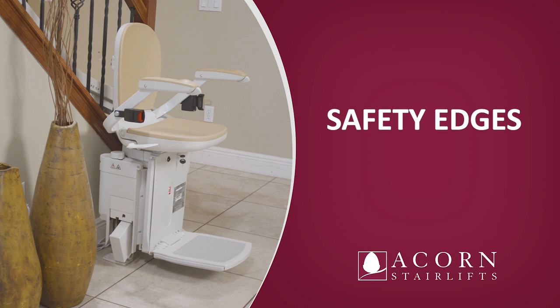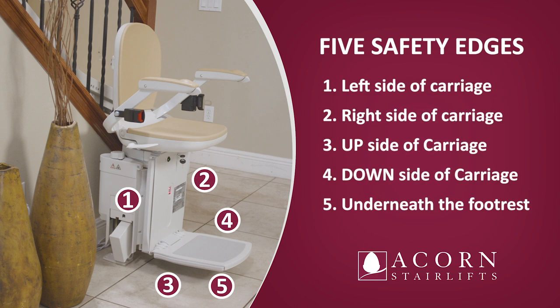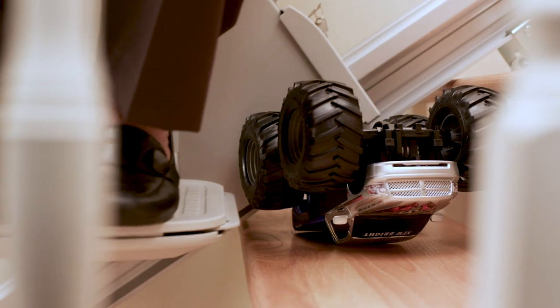Safety edges. Before operating your stairlift, ensure that there are no obstructions on the staircase. The stairlift is fitted with five safety edges: each side of the carriage, each side of the footrest, and under the footrest. If these encounter any obstruction, the stairlift will stop immediately. Move the stairlift back in the opposite direction and remove the obstruction.